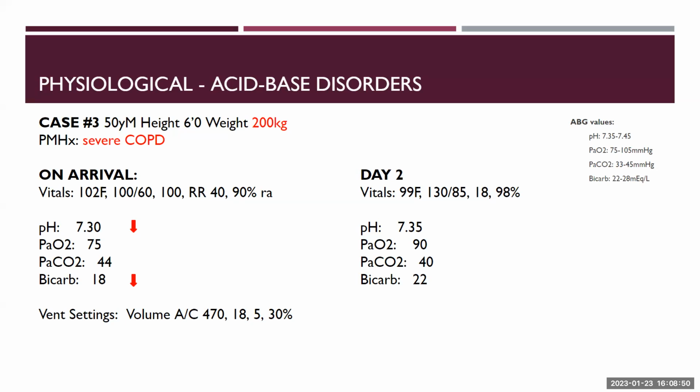I will volunteer Wade to take over. Yeah, based on all the numbers, things are looking much improved, kind of across the board, vitals wise, as well as on the blood gas. So again, with someone with severe chronic COPD, we'd expect CO2 retention. I'm not sure what the patient's baseline necessarily is, but based on all the numbers, things look good at this point.